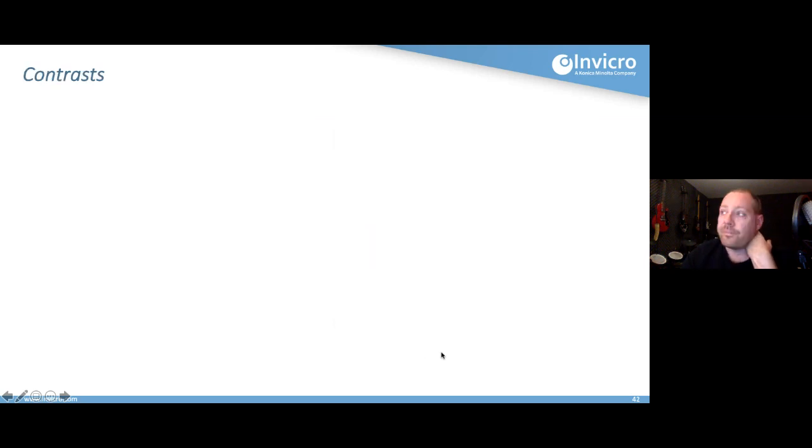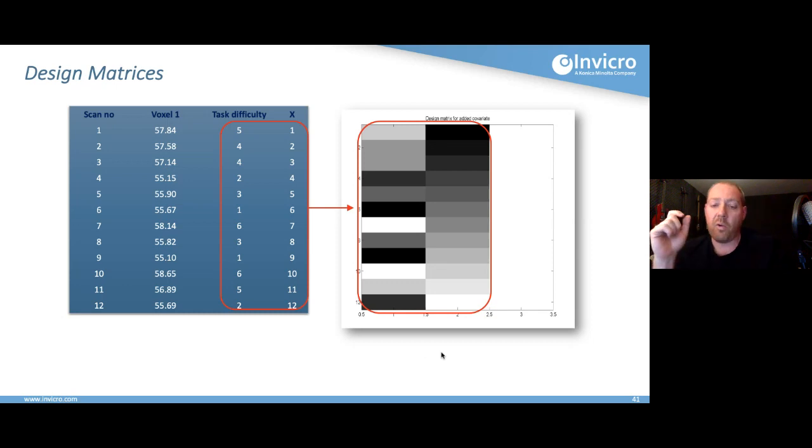And what you're doing by adding in another variable is, rather than fitting a line on a 2D graph, you're fitting a plane on a 3D graph. And obviously you can extend that and add more and more variables, and you end up fitting a 3D surface in a 4D space, or a 4D object in a 5D space, or whatever, which is impossible to imagine, but mathematically it's basically the same thing.